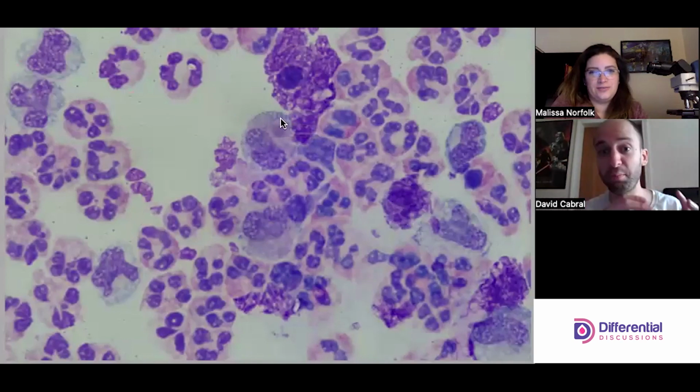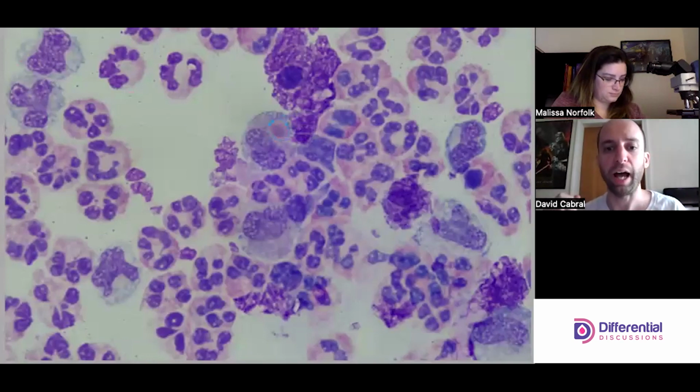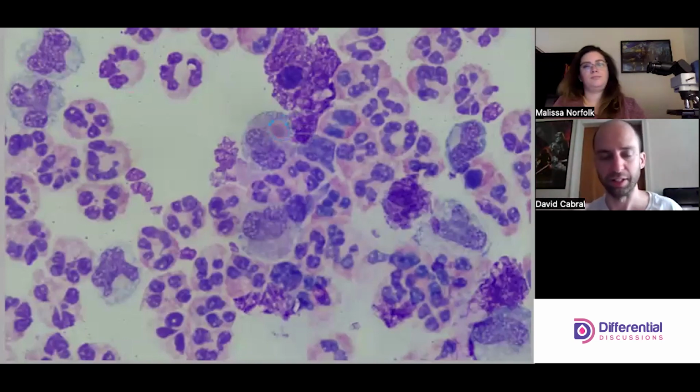It would appear to me that a monocyte macrophage, whatever we would like to call it, has eaten probably a dead or dying neutrophil or some other kind of debris. So this brings us back to the physiological functions of the cell. Macrophages, monocytes are kind of the garbage men, a very important function of removing materials, and it's part of healing, right? So as cells die off, tissue cells, whatever it may be, macrophages are going to eat that stuff and digest it down.